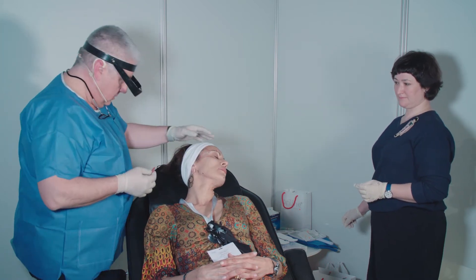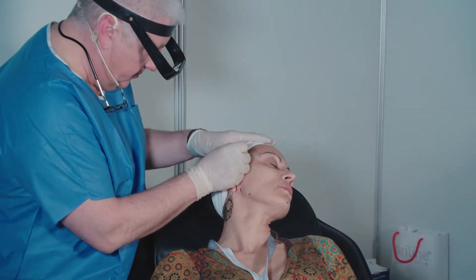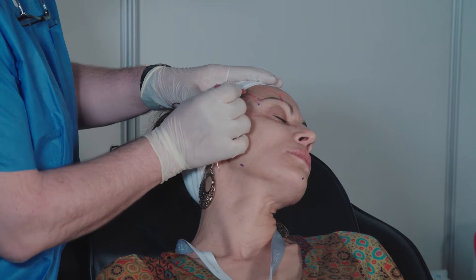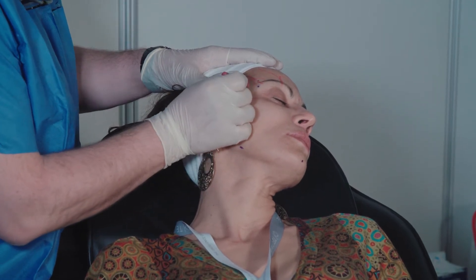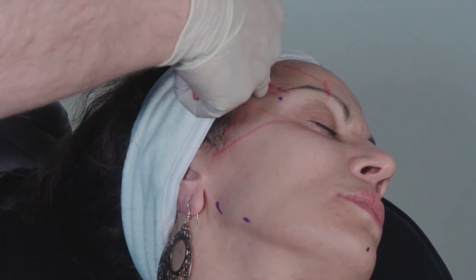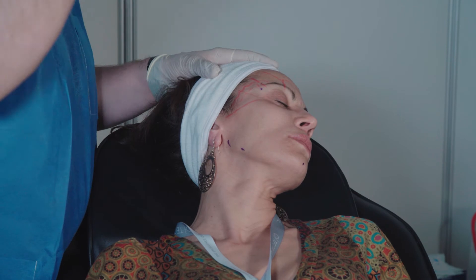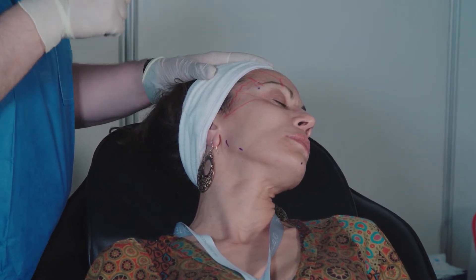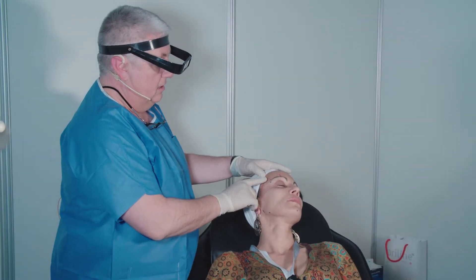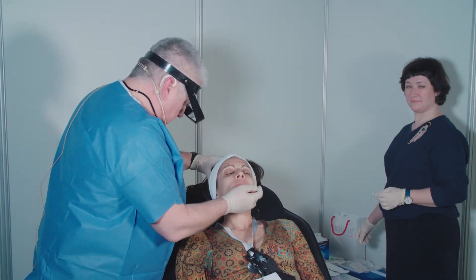You will find the product after 2 or 3 hours in the jaw because it follows the normal path of the temporalis muscle. So, when injecting, you can cross the superficial temporal artery, and between the orbital rim and the superficial artery you can find the projection of the facial nerve. But even if you cross them at a 90-degree angle through the skin, you will inject deeper — near the bone — and near the bone there is no risk. It's a dense zone if you inject superficially, but if you inject near the bone, there is no problem.